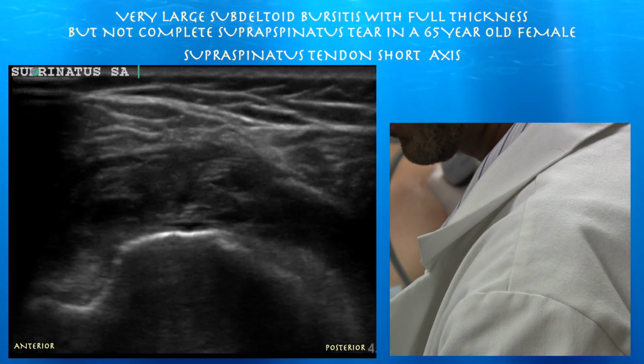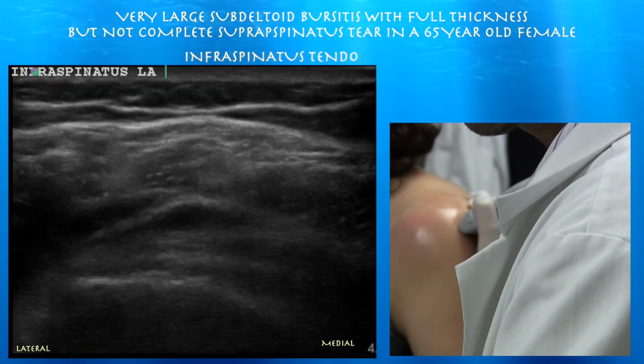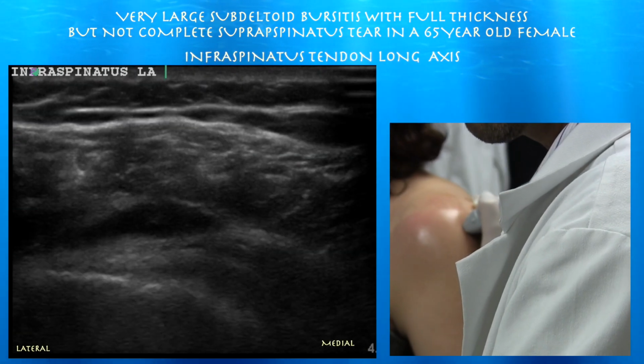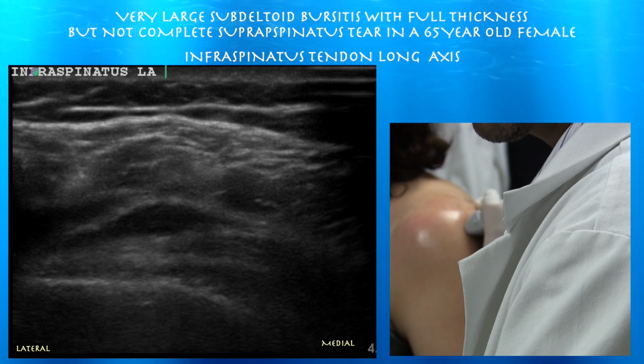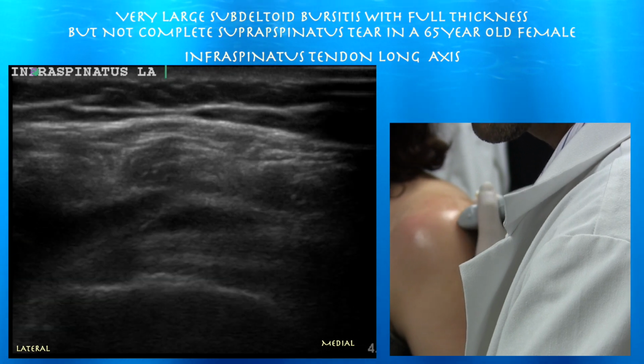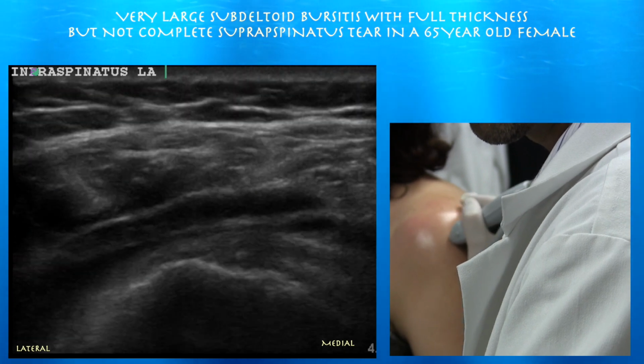Here we are looking again. We've got the greater tuberosity, with a very large fluid collection above that. Infraspinatus tendon, you can see even some fluid above that. Here the infraspinatus tendon looks preserved, but it does have some fluid above it, probably from the rotator cuff tear anterior to it. But the tendon itself looks okay. Right side of the screen is medial. You can see it inserting on the greater tuberosity.